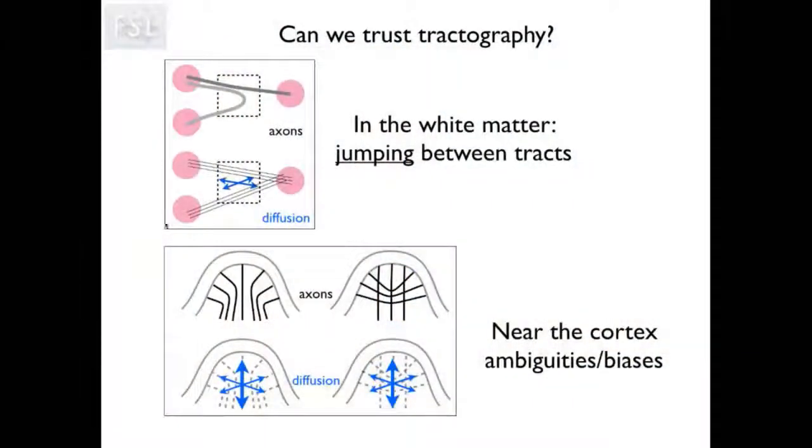So if we now have a three-region scenario and we know that this is actually the structural connectivity profile of them, what we're going to get with tractography via this voxel is that these regions are not going to be connected, and we're going to have a connection from this region to both of them, right? Because of the confounds that I just described.